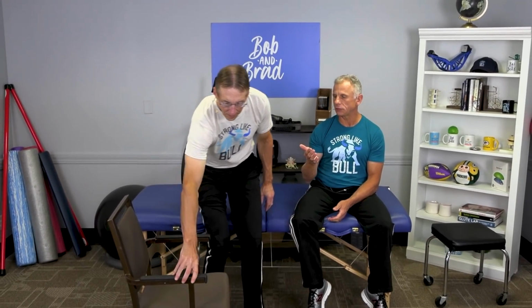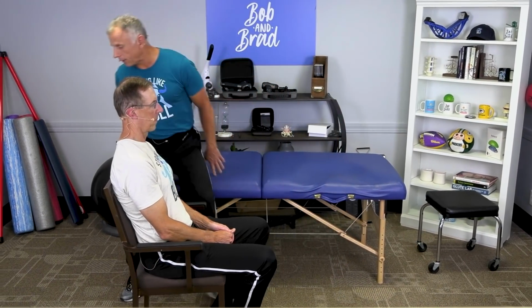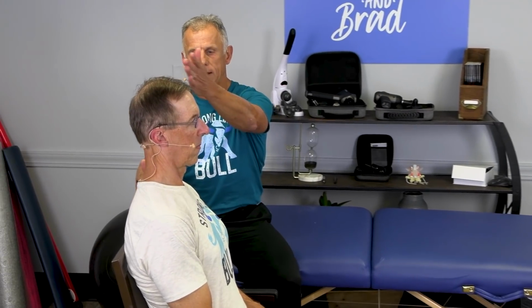But anyways, why don't you sit down, Bob? You can do traction, and this is a nice way you can do it at home if it fits appropriately. But when I do this in the clinic, Bob, is your bottom scooted all the way back? Yep, it is. Okay. So he's going to start out in good posture. Bring your head back over the shoulders. There you go. Are you relaxed, Bob?